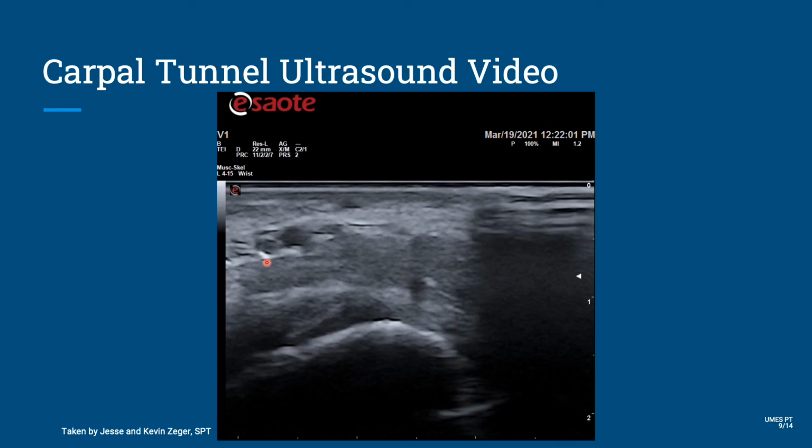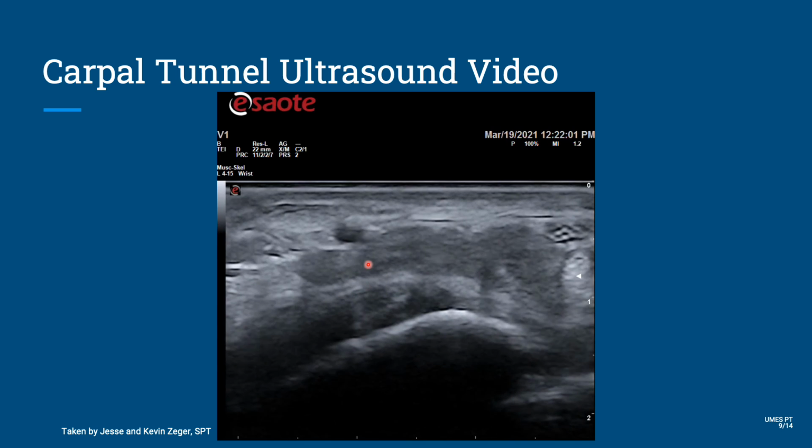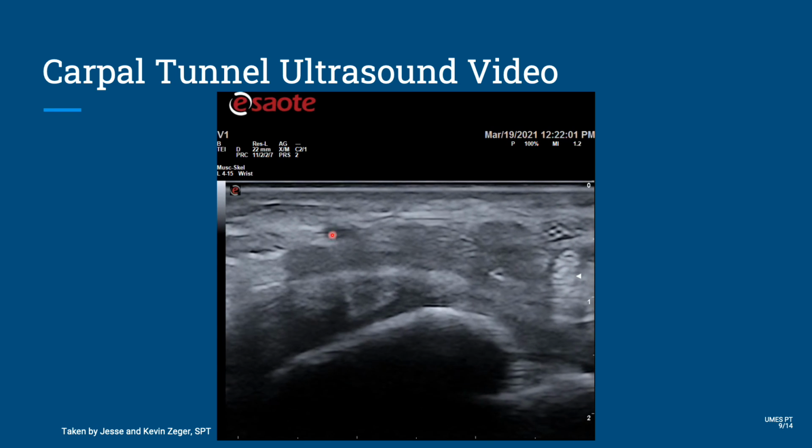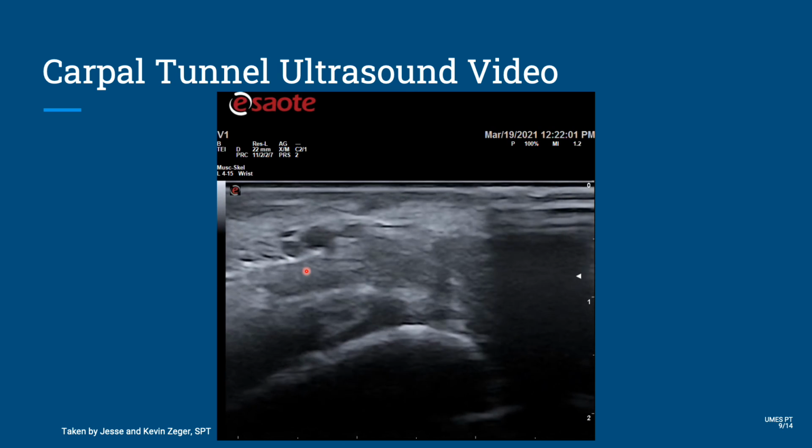You can watch that video one more time. And it's compressed, they disappear, the artery is barely there, and then they come back.